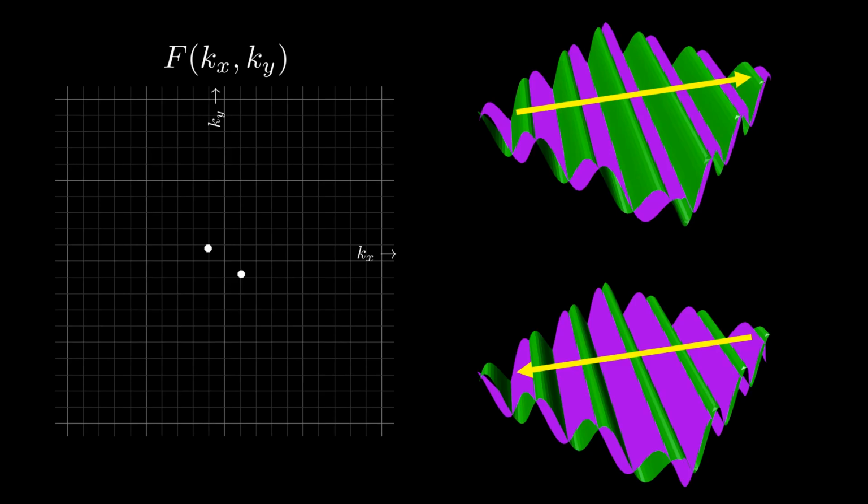Remember when we took the Fourier transform of sine a bit ago, we found that for an entirely real function the Fourier transform must be symmetric about k0 because necessarily the imaginary components must add to 0. Same thing here. K-space of real functions is Hermitian. If the image is entirely real, necessarily reflected positive and negative frequency components will sort of counter-mirror each other. They are each other's complex conjugates. Check out Mario's k-space again, and you see that every point's magnitude is equal to his buddy mirrored across the origin. So does this mean that half of the k-space information is redundant if the image is real?